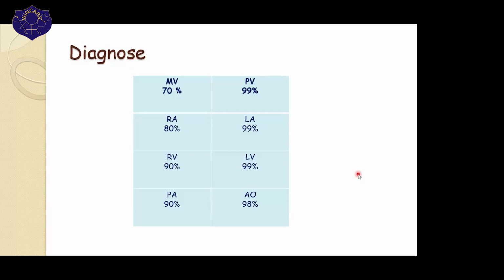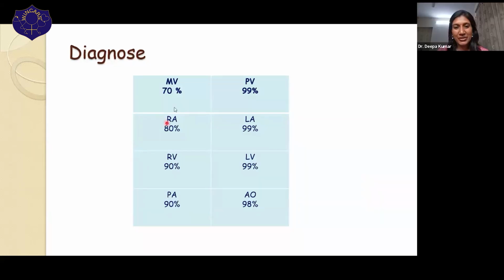Atrial level, they say. Okay. One is at the atrial level. Any other abnormality? Is there any step up anywhere else? So you have a further step up from RA to RV as well. So it should not be taken as just one step up. We should always continue to see if there is any further step up in any of the chambers.